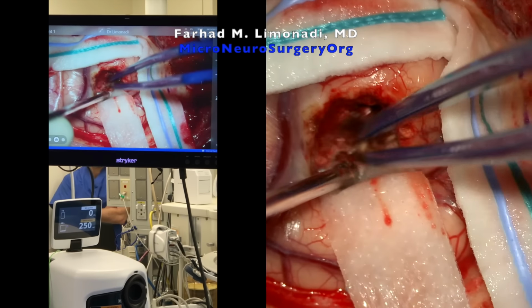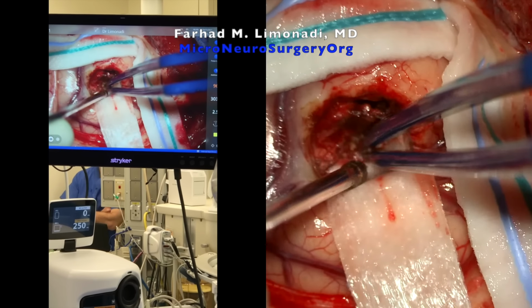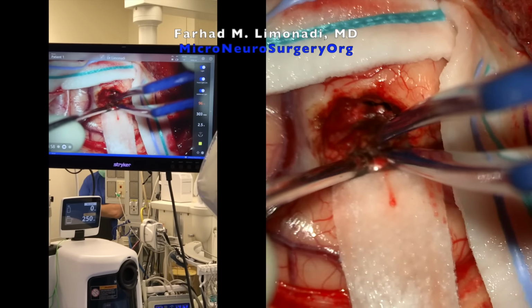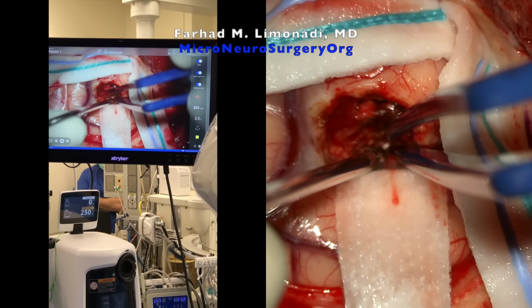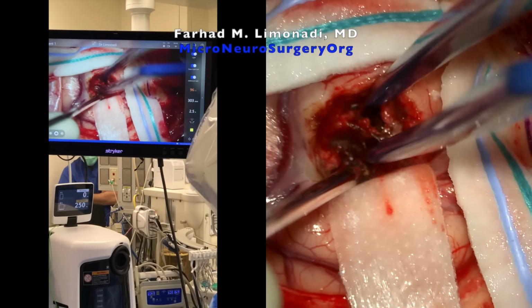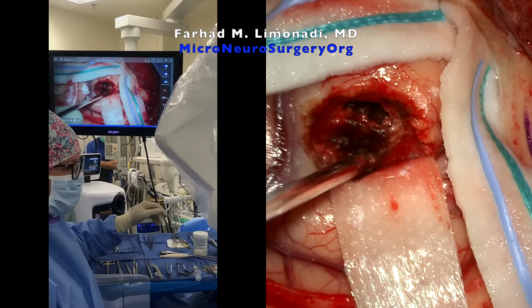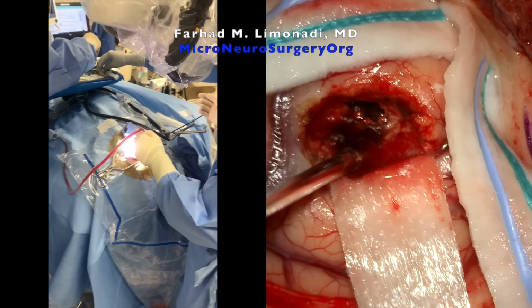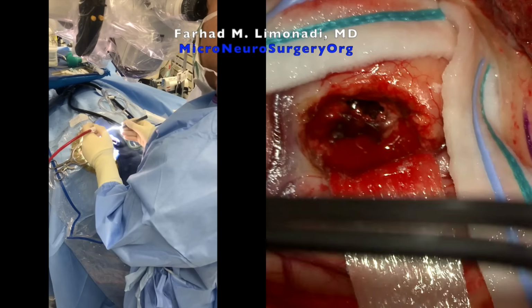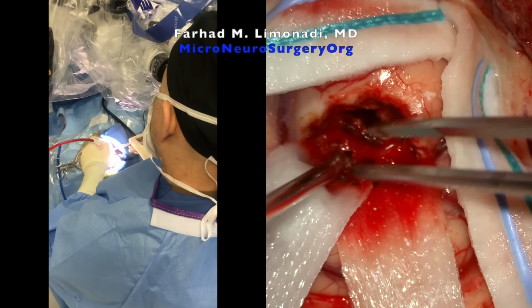Now we're not pushing on the brain, but moving along the border of the capsule. And only apply heat to the tumor, not the brain. Very key here. And can I see another one, please?